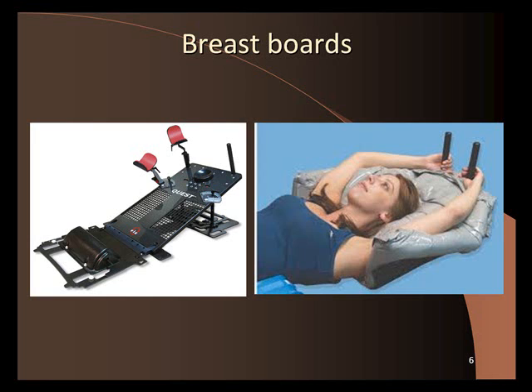Now this stuff here is made with two chemicals. It's an epoxy type material, and that's what this is in this picture. They place a bag that looks like a garbage bag, and then before the patient lies down, they pour this chemical. Well, first of all, they take these two chemicals and they mix them together and they shake them up, and it creates a reaction. Then they pour this mixture inside the garbage bag. They close it up with tape and they spread it out evenly, and then the patient lies down on there, and that foams up. So the chemical reaction creates this foam. That foam bubbles up around the patient.